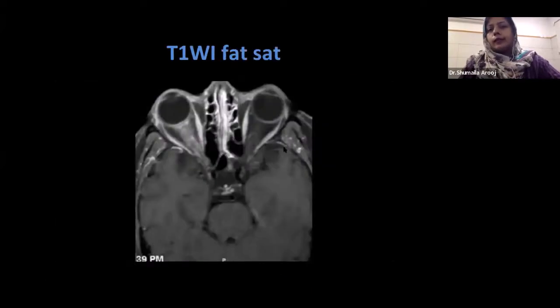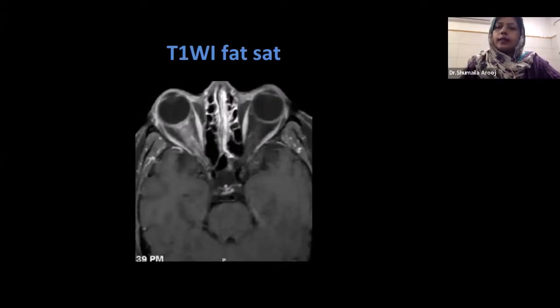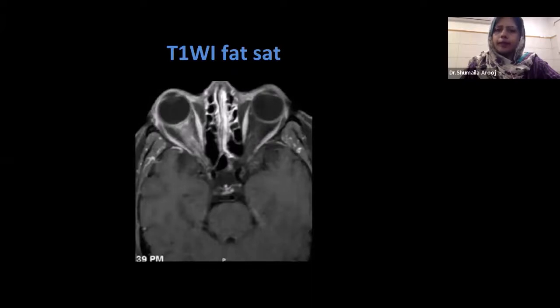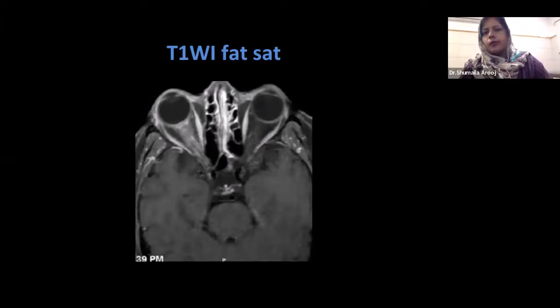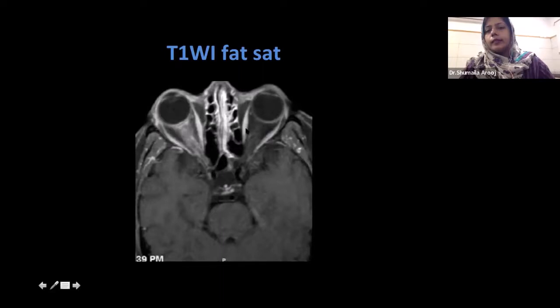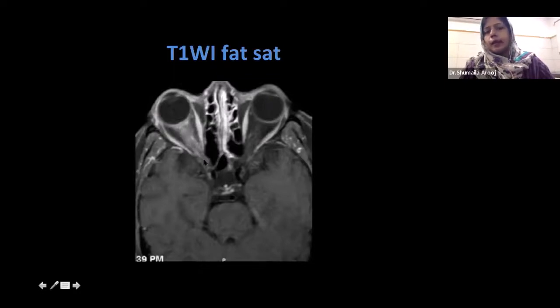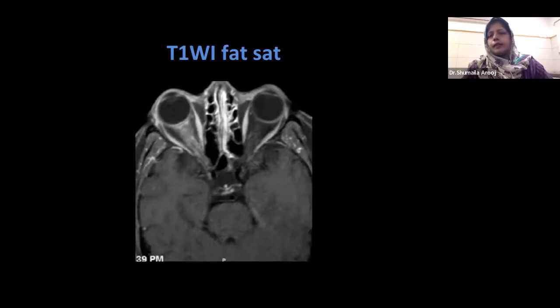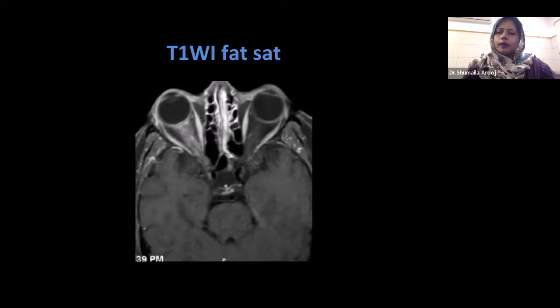These are T1-weighted fat-saturated images. As I mentioned, subcutaneous fat is bright on plain T1-weighted images. T1 fat-sat images are ideally done in cases of orbits because the intraconal fat is already bright and we are unable to delineate between the pathology and the normal fat signals. In this image, you can see that the fat is suppressed homogeneously, but there is some enhancing enhancement around the right optic nerve — this is an abnormal right optic nerve. If we had not suppressed the fat, these signals would have merged with fat signals and delineation would not have been convenient. So fat-sat T1-weighted images with contrast are performed in almost all centers.